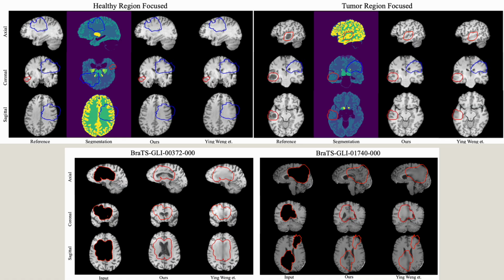And the bottom row is the validation set. As there's no reference inside the voided areas, we judged instead the plausibility and could find coherent anatomy, minimal seams, and balanced intensities across the tissues. So overall, the visuals are realistic and anatomically reasonable, which complements the quantitative results.